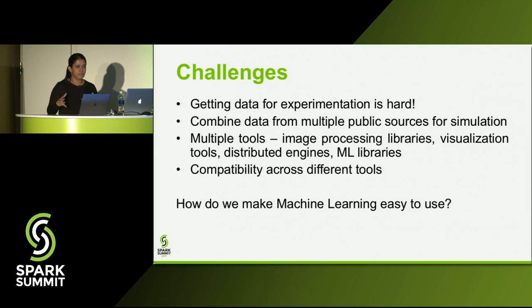So how do you create an environment where you can build a system without actual real-world data? Multiple tools exist. For example, you might need image processing libraries to run filters, to run dimensionality reduction. So that's maybe one suite of tools. Then you might have visualization tools. That is, you want to open up the image and see what it looks like. So you have your visualization tools coming in.